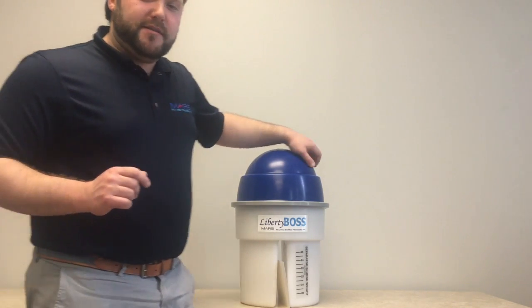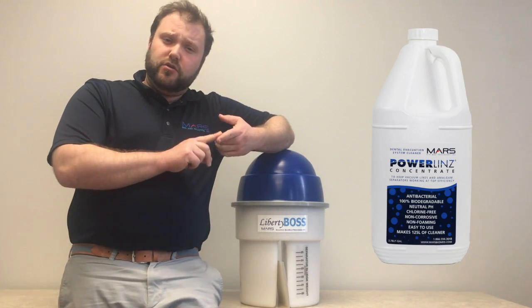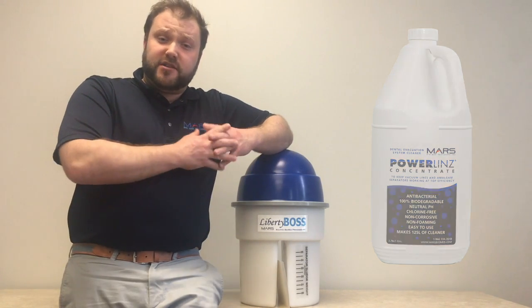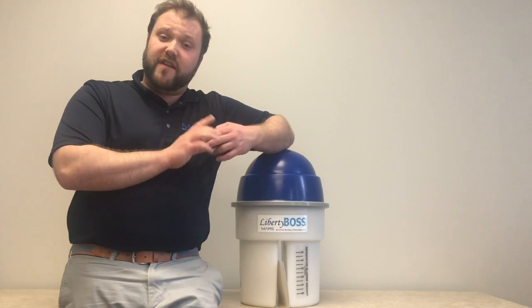The only required maintenance that Mars asks of your practice is to do a daily line cleaning using a neutral, non-foaming evacuation line cleaner. This is a process you're most likely already doing, as it's good practice to maintain your suction lines and your evacuation pumps.